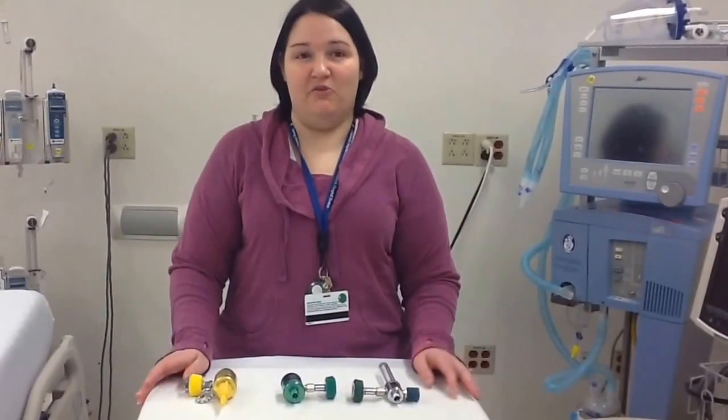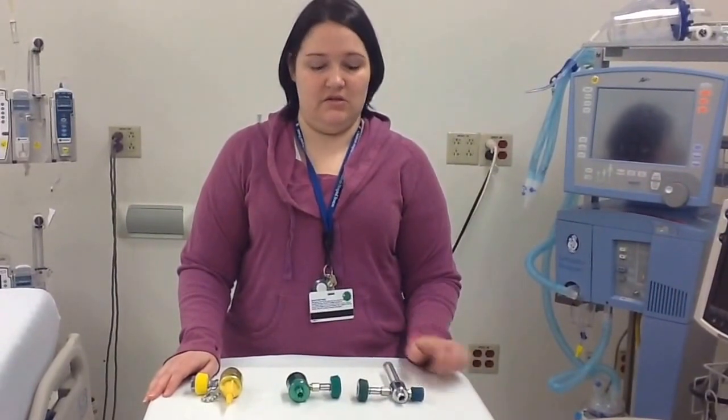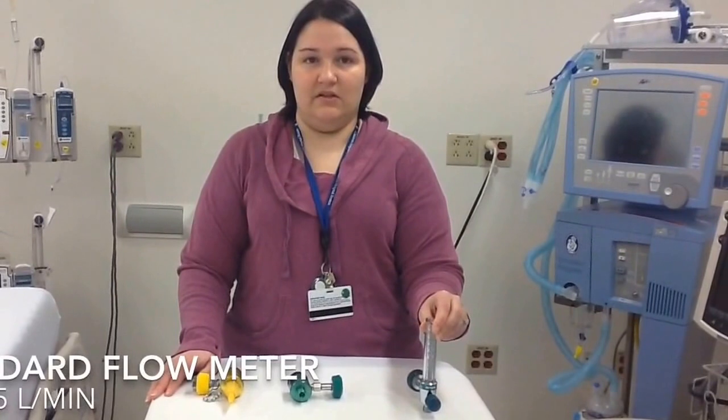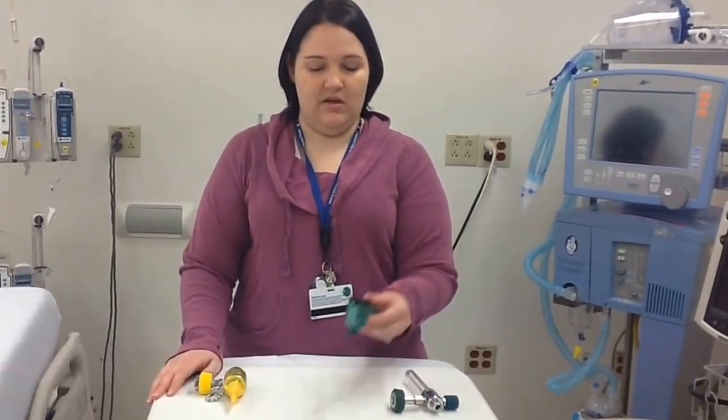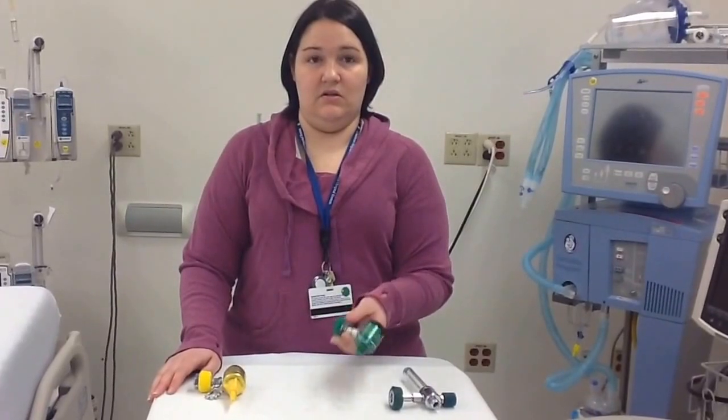I'm going to talk to you about flow meters. We have 3 different types of flow meters. The first 2 are oxygen flow meters. This one here goes from a half a liter up to 15 liters, and the next one down is a low flow meter. It goes from 30 cc's up to 4 liters of oxygen.